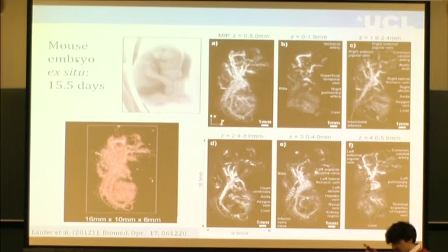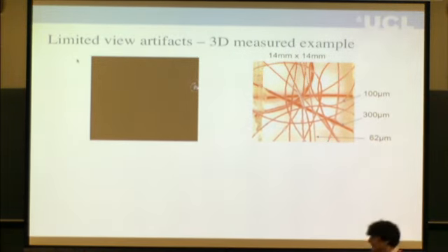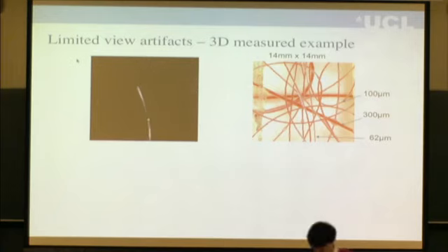They're all slightly cheating in that they're all showing maximum intensity projections of their 3D data set. If we look at actual slices of an image, so here's a simpler image, just some blood-filled tubes. And this is lying on our sensor, so if you like, in the plane here is our sensor. On top of the sensor, I've reconstructed the data, and I'm just going to fly through it over here, and you'll see the vessels appear, and then after the vessels have gone, you see the sort of train tracks.